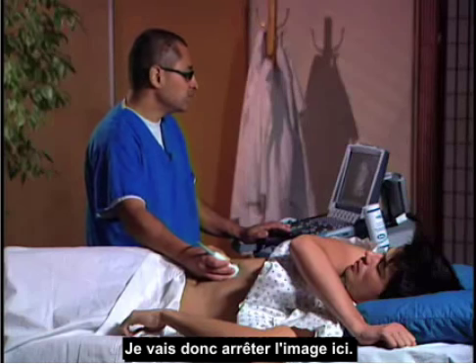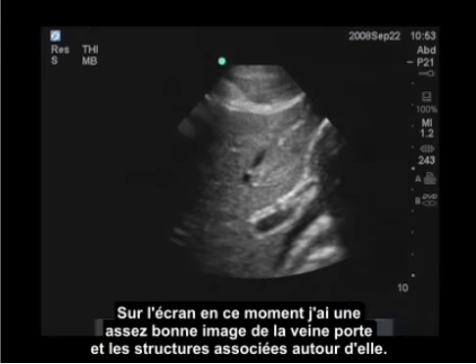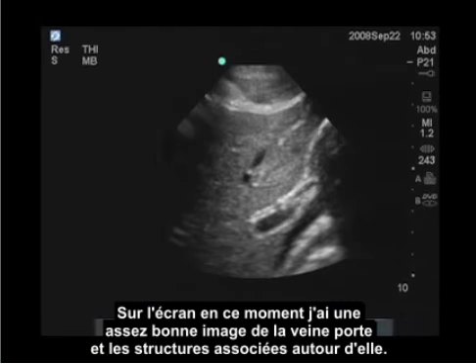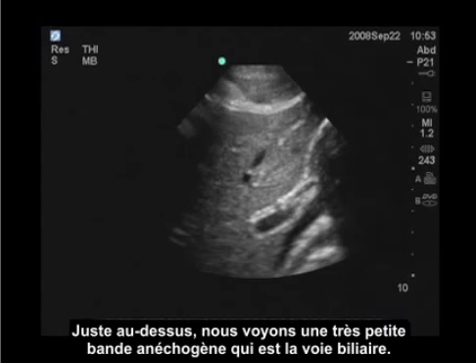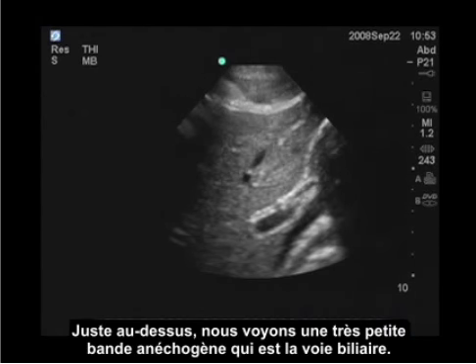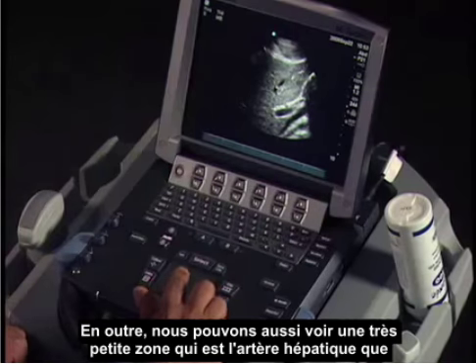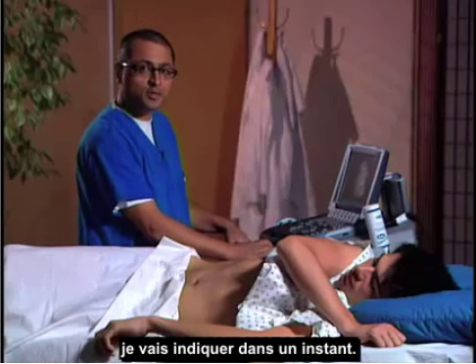I'm going to freeze this here. On the screen right now, I have a reasonably good image of the portal vein and the associated structures around it. Right above it, we see a very tiny anechoic stripe — that is the bile duct. In addition, we also note a very small area which is the hepatic artery, which I'll point out in a moment.